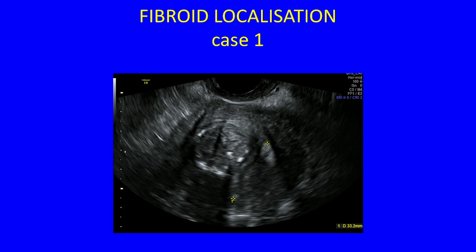When you're looking at a fibroid and you can't quite work it out, have a go at 3D because it might just give you the answer. In this longitudinal view of the uterus, there is a fibroid and a bit of cavity, but exactly what's going on is harder to see. Whereas on 3D, it became really clear that the fibroid is deviating the entire cavity sideways.